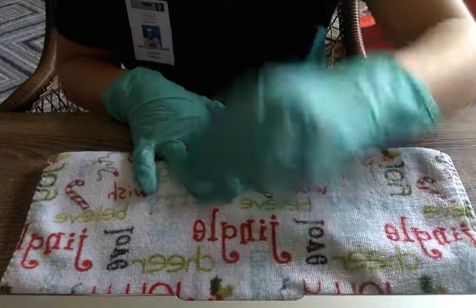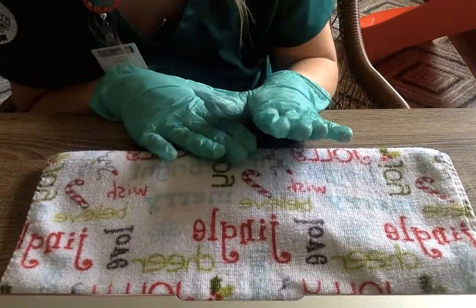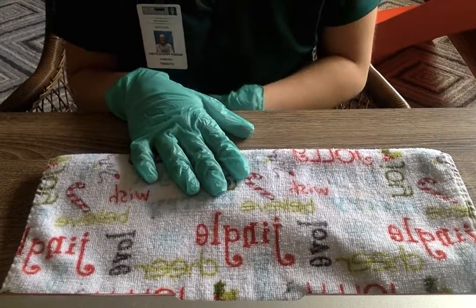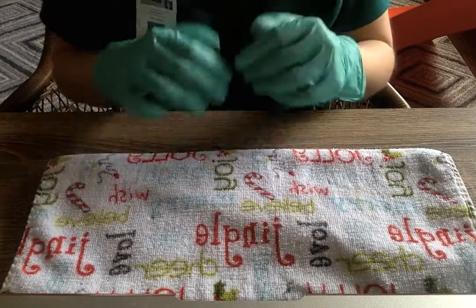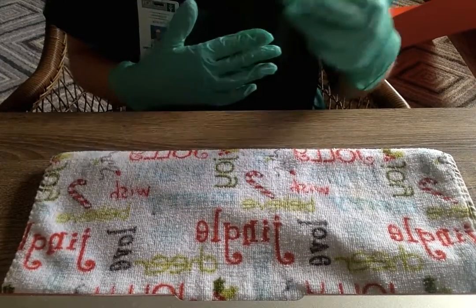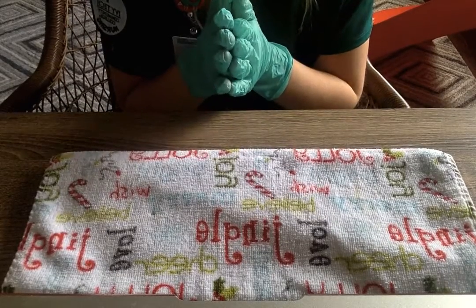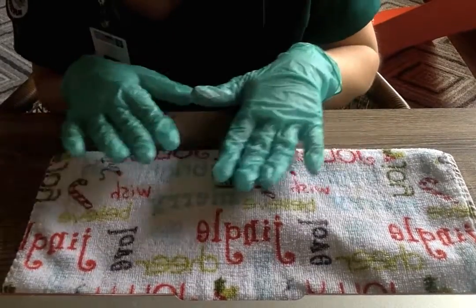Okay. And so for the next one, we're going to be doing the Humalog, which is the insulin. And there's a few different areas that you can do this at, but for this specific video, I am going to be doing it in the abdomen, about 2 fingers down and away from the umbilicus, so around in this area. And a big thing that you want to make sure with insulin is that you're rotating the injection site. So you want to look on the computer beforehand and see where the last injection was, and wherever it was, you just want to rotate it from that spot. So that's what we're going to do.